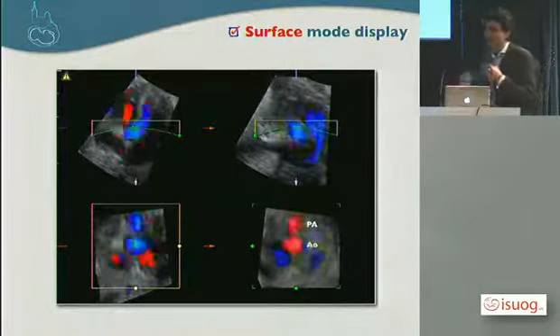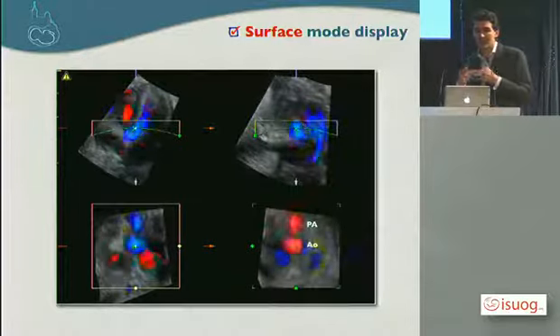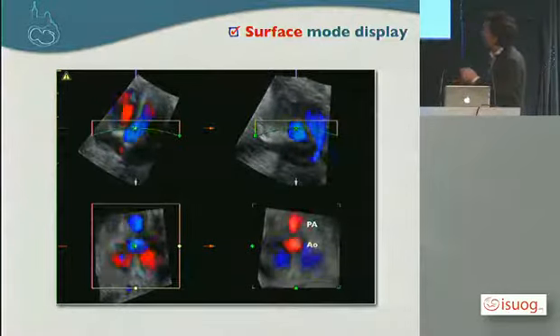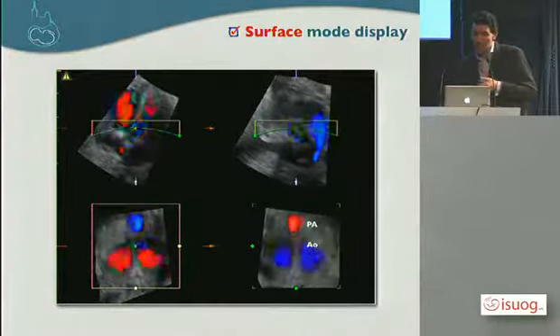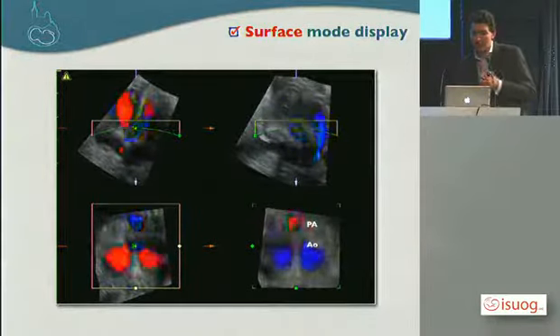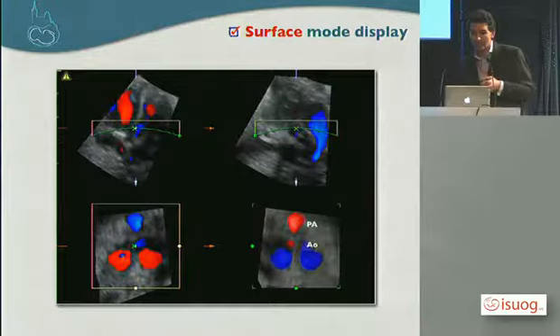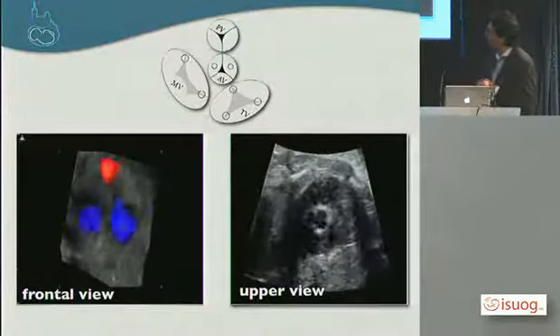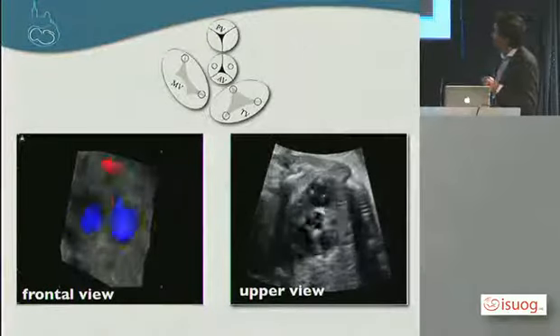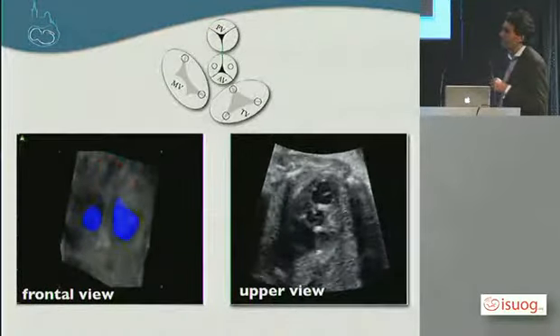This is a normal organization and distribution of the vessels. It is what we call the normal en-face view of the main vessels. In some pathologies, especially artery malposition and transposition of the great arteries, we will check afterward how it can look. Here, for example, in 2D, it's also possible to make this view, but it's a little bit difficult.